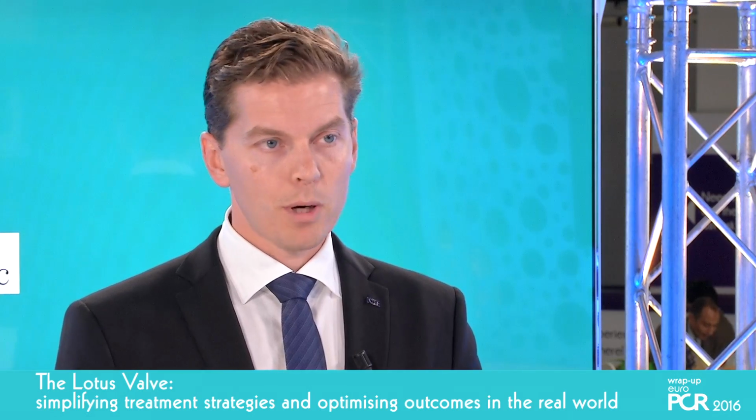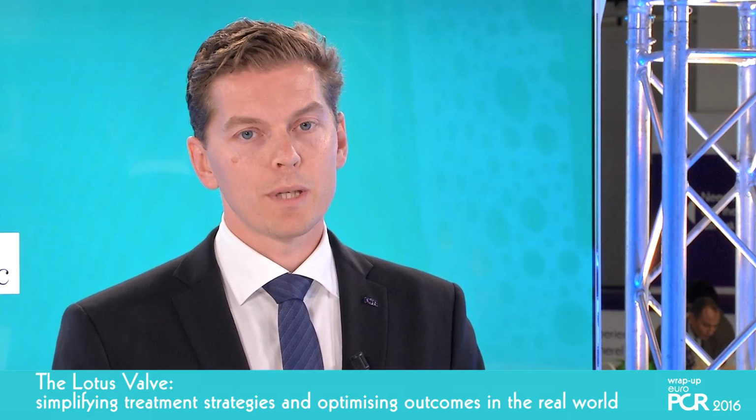So I think it's probably those two factors that account for low pacemaker rates. And we also have some other reports from Germany and England coming in demonstrating that we actually have comparable pacemaker rates with other valves on the market. So as we gain experience, I think we will start to see those numbers coming down. So high implantation and less oversizing will bring it down in the same range as the leading valves on the market.